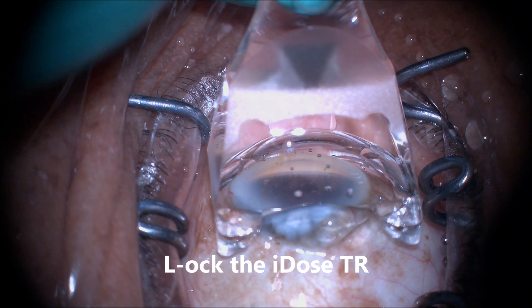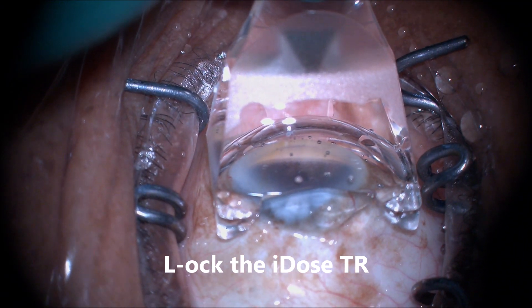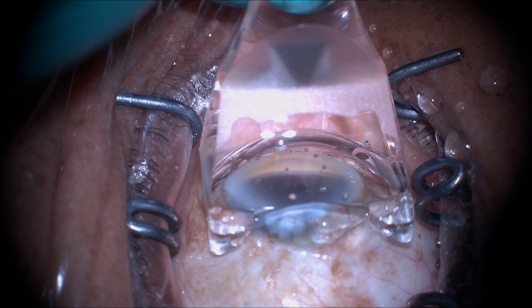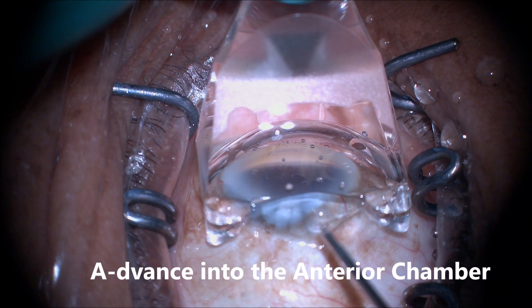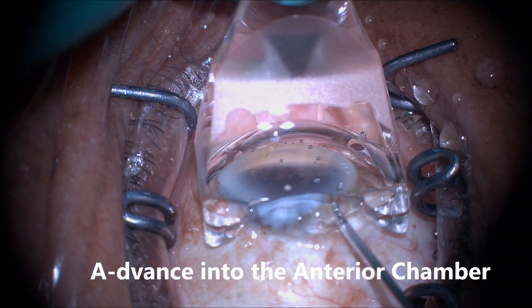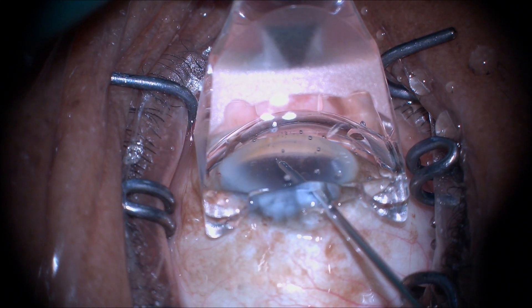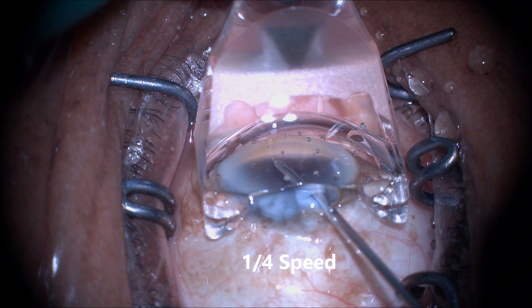We're now going to lock the IDOS-TR release button forward so as to not prematurely release the IDOS implant. We're next going to use the inserter to advance into the anterior chamber. We go through the clear cornea incision and aim for the trabecular meshwork.